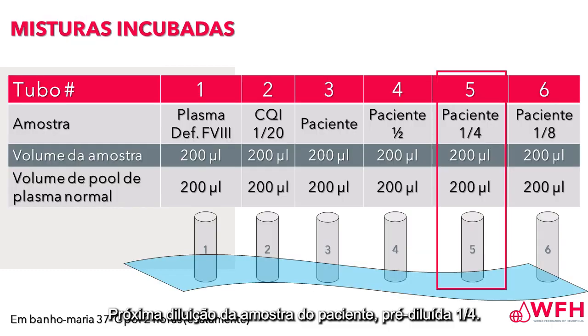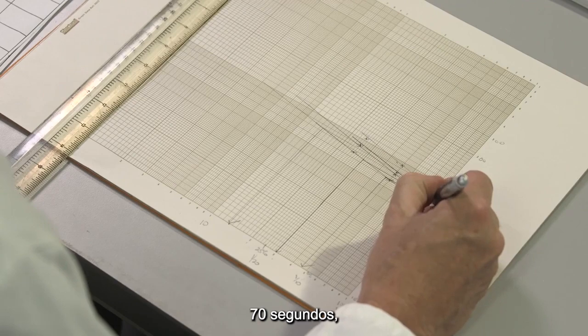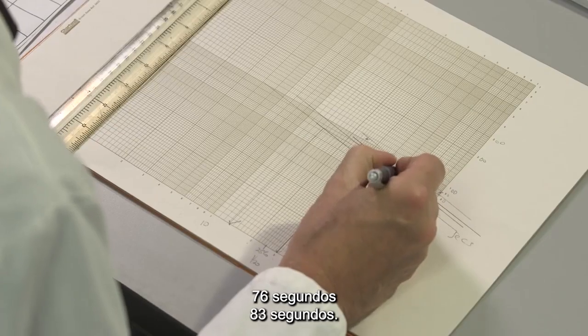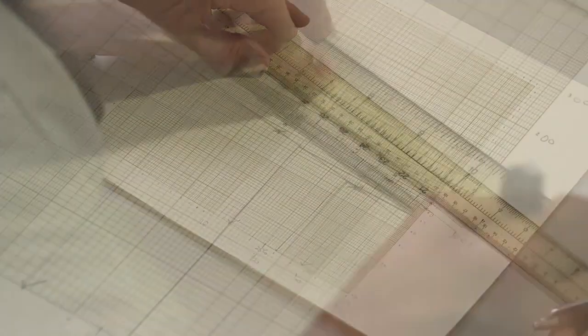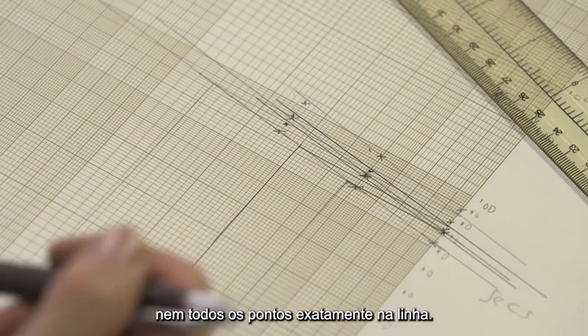Next dilution of patient sample. Pre-diluted 1:4, mixed with pooled normal plasma. Clotting times, 70 seconds, 76, 83. So, line of best fit. So we have a straight line relationship. Once again, not every point exactly on the line.